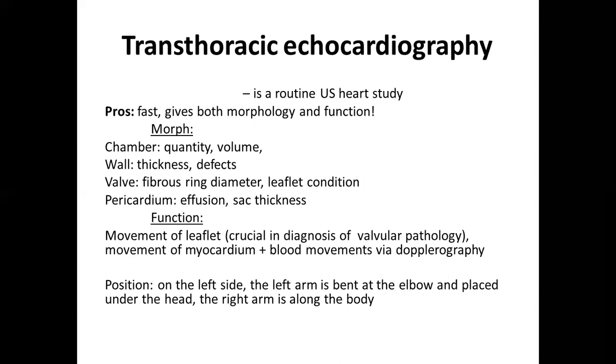So let's speak about ultrasonographic techniques, and the first one is echocardiography, transthoracic echocardiography to be exact. That is a routine heart study using ultrasound. So what are the actual benefits? It's a very fast technique that gives you both morphology and function.